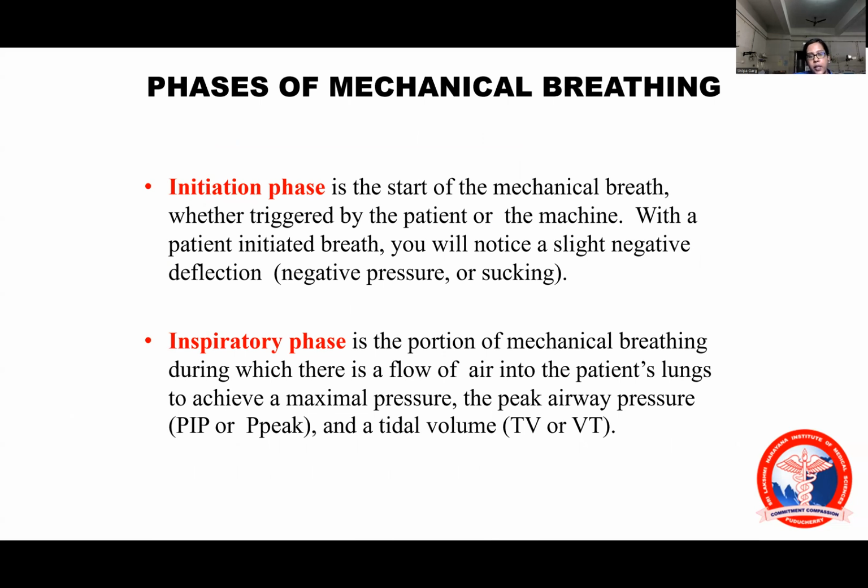Then, phases of mechanical breathing: the initiation phase and the inspiratory phase. We have something called the initiation phase. It is the start of the mechanical breath. It can be triggered by the patient or the mechanical ventilator. Once the patient initiates a breath, you will notice a slight negative deflection, because we, as humans, take in breath by providing negative pressure ventilation, right? We produce a negative pressure inside the airway, and thereby we start sucking air from the atmosphere.